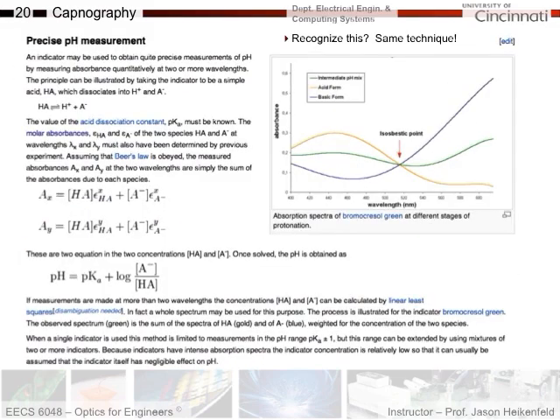And if you want to do really precise pH measurement optically, you use a spectrometer. And like we did for blood oxygen level, you look at the isosbestic point where something would change color based on the acid form versus the basic form. This is the wavelength of the absorption. And you do the same things we did before with multiple wavelengths, and you can get a precise calculation of pH using a spectra instead.